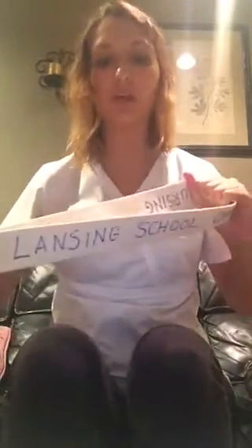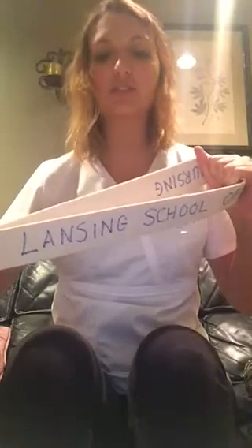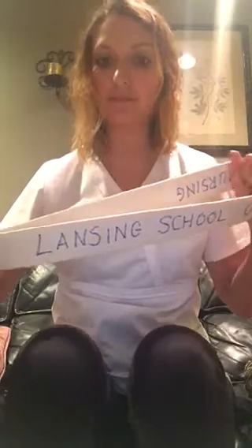If you're transferring a patient, you're going to stand in front of them and hold on to the belt. Using good body mechanics, because we don't want to hurt our backs, we're going to help lift up and reduce some of that pressure off of their lower legs. And then we can even turn and sit them back down. If you're using this while they're walking, you're going to want to stand next to them or behind them, and just hold on to it. You can even lift up a little bit to reduce some of that pressure, but this is just to reduce the chances of them falling.